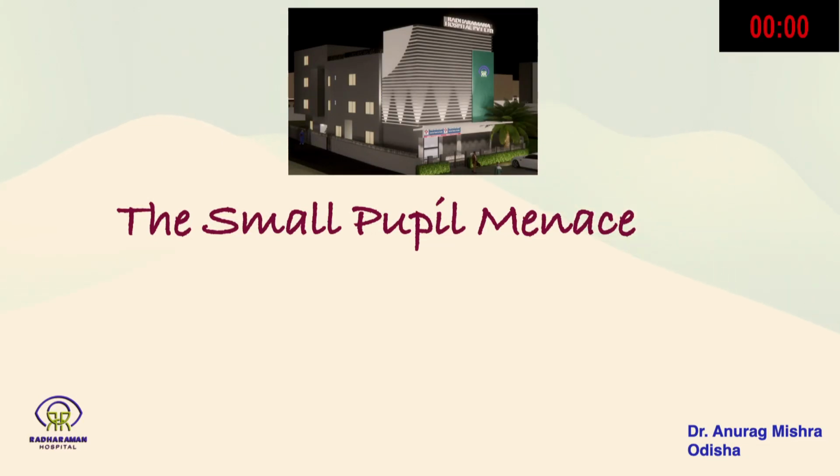Sometimes with the chandelier you have to go to the pars plana, which may be difficult for an anterior segment surgeon, but these Epsilon people can make for you an illuminated chopper. So you have the illumination in the chamber as well as you can chop the nucleus. You can inquire from Epsilon. No financial interest.